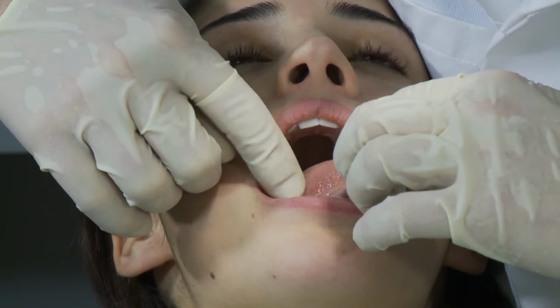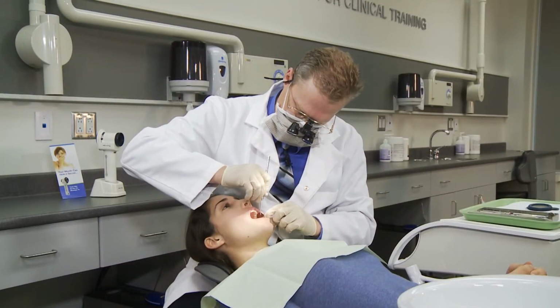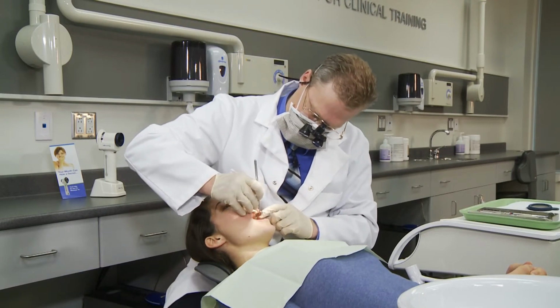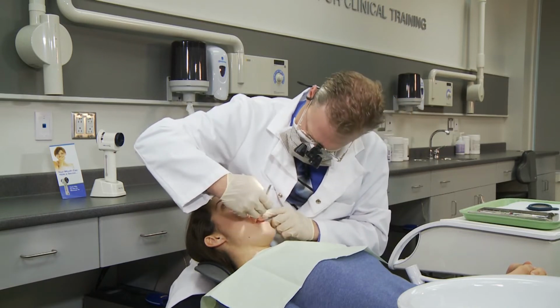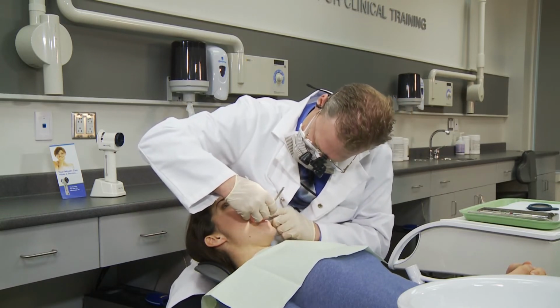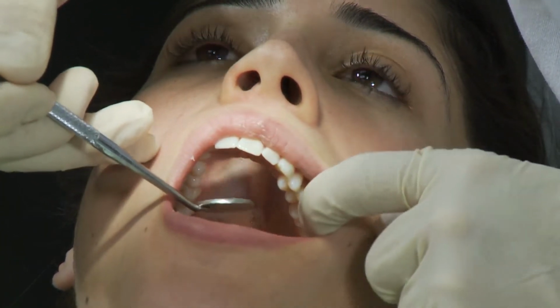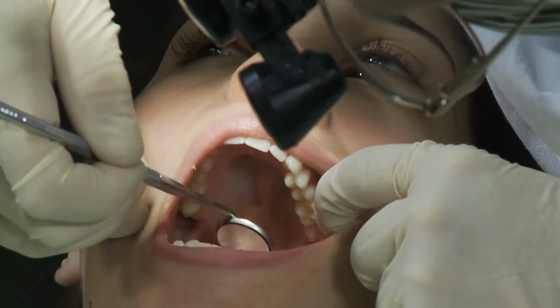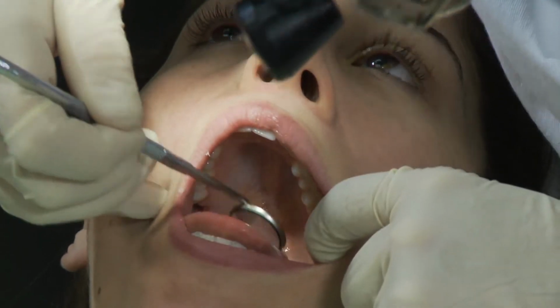Some conditions that may appear dark under VELscope include traumatic lesions such as chronic irritation from denture friction or cheek biting, pigmented lesions such as melanotic macule, common infections such as oral candidiasis and recurrent herpes, and inflammatory conditions such as aphthous ulcers, or vascular lesions such as varicosities, hematoma, or petechiae secondary to trauma.